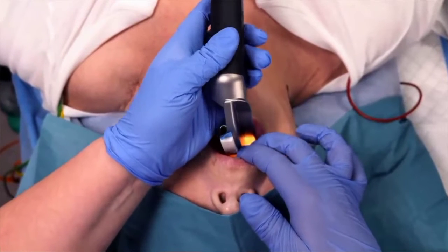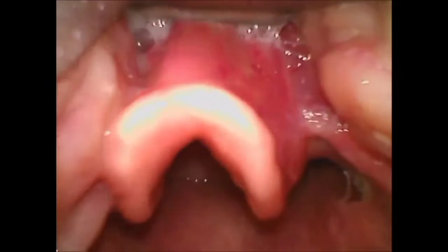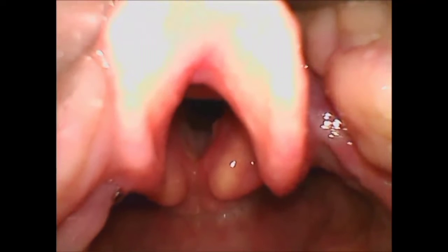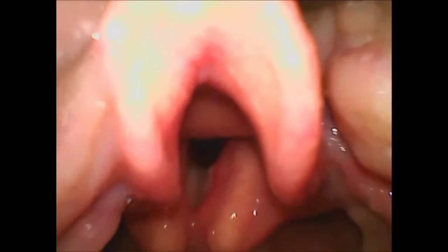The aim is to create an unobstructed line of sight to the larynx by pushing the tongue to the left and lifting the epiglottis, exposing the vocal cords. This requires precision, not brute force.